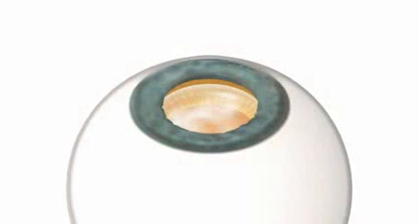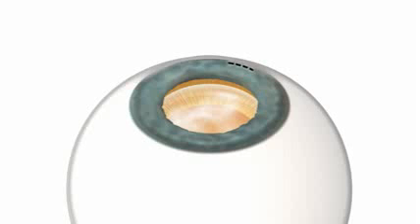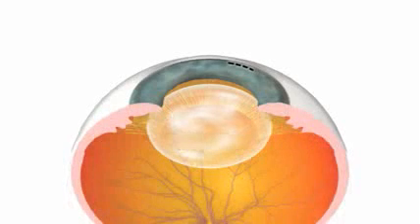A tiny cut is made on the surface of your eye. The cut or opening is usually so small that no stitches are needed after the operation.